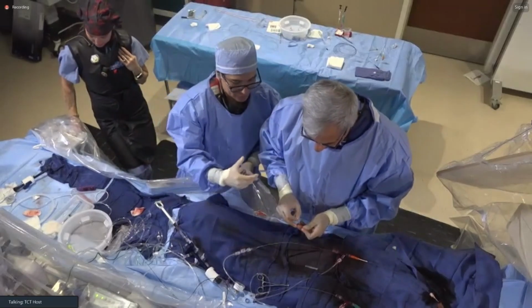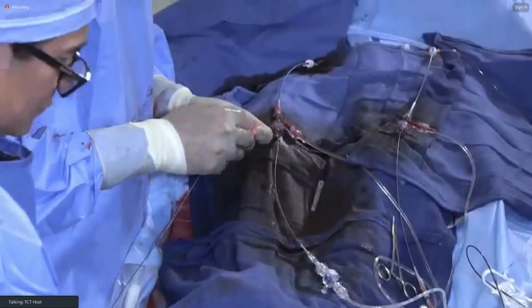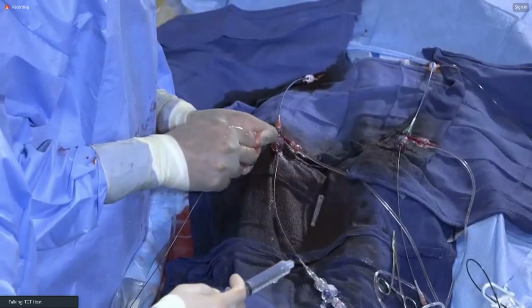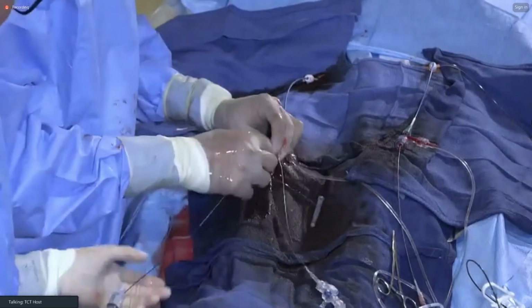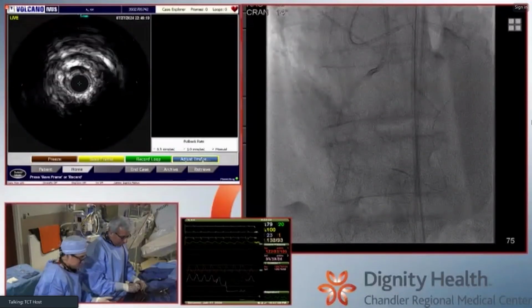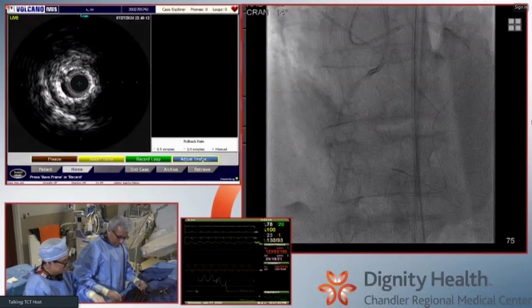But you also feel comfortable it'll cross, because that's the one thing, that sometimes ballooning it first. I think I ballooned it far enough, I think through the 3.0, all the way down, the distal segment, right? Yeah. I can't read these.